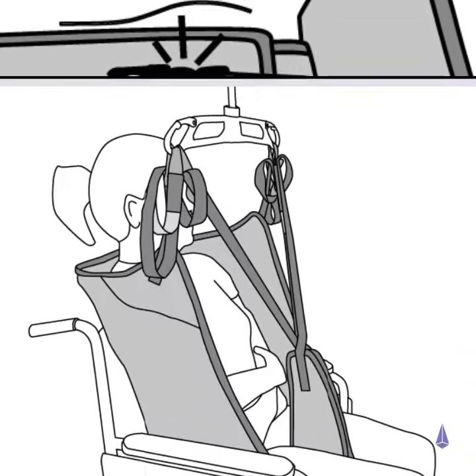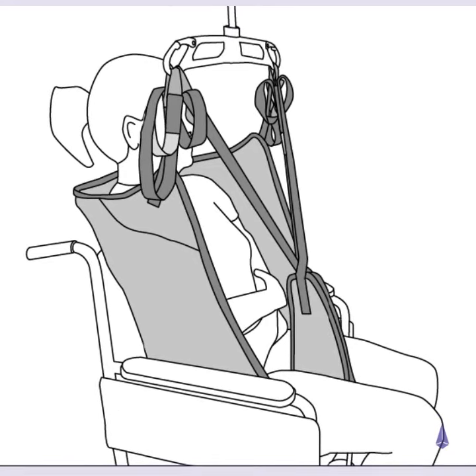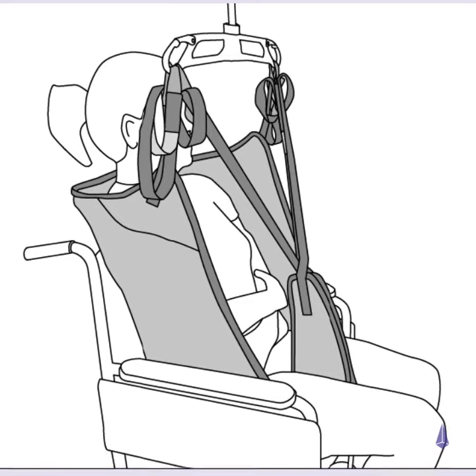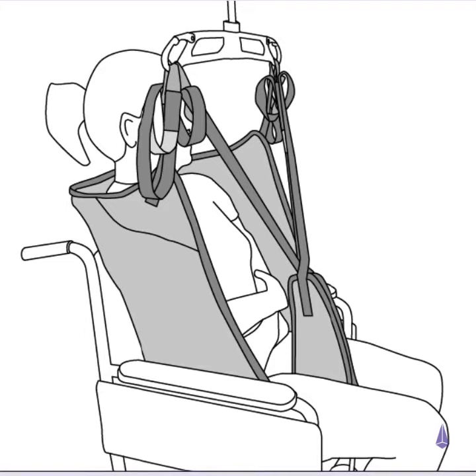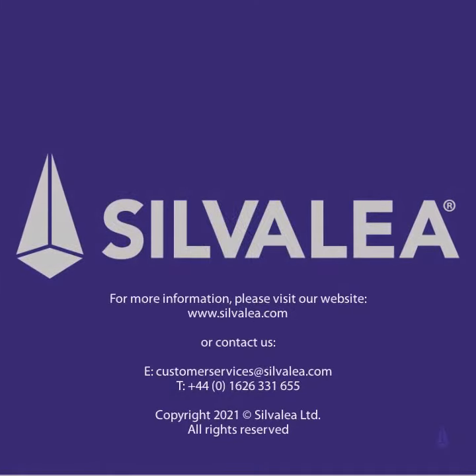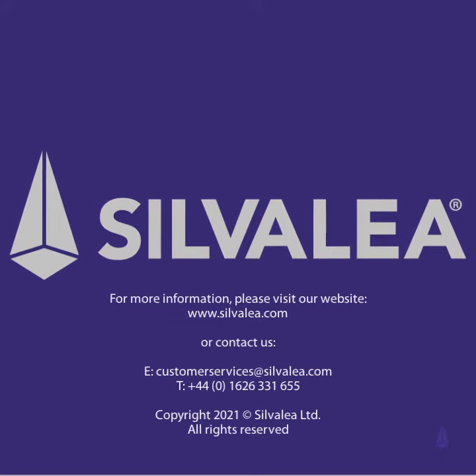Attach all the remaining tapes to the hoist using the appropriate colored loops for the required positioning. Ensure tapes are not twisted and are securely attached before transfer. For more information, please visit our website www.silvalea.com.